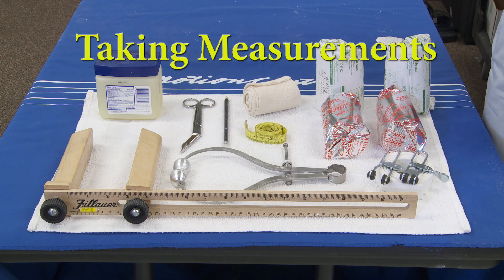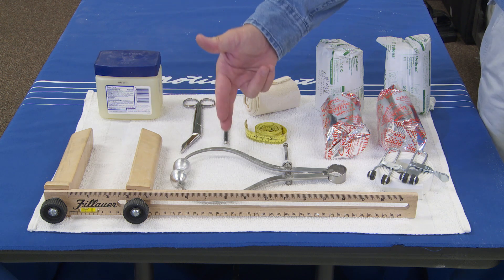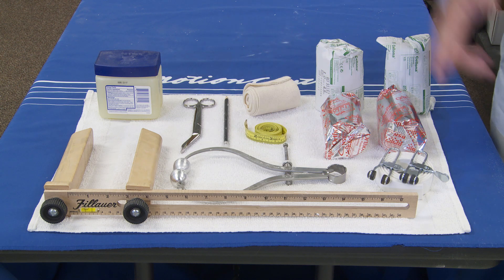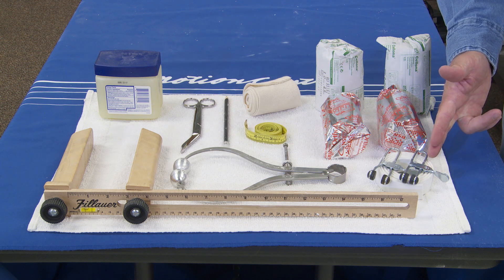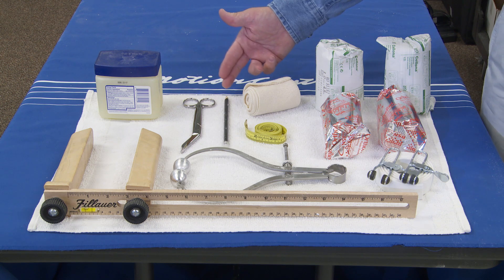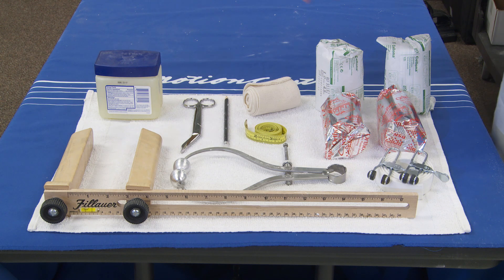For measuring and molding, you will need a flat-bladed Ritz stick, outside calipers with a smooth surface, a tape measure, one inch elastic, Yates clamps, cotton stockinette or tubigaws, an indelible pencil, bandage scissors, parting agent, four or six inch rigid plaster for splint, and two rolls of four inch elastic or rigid plaster.